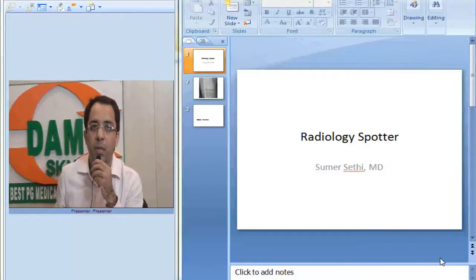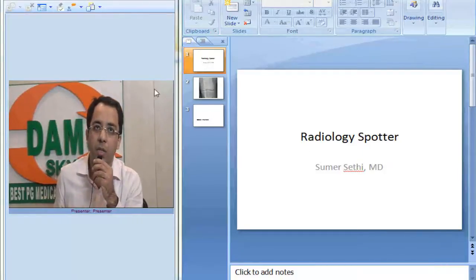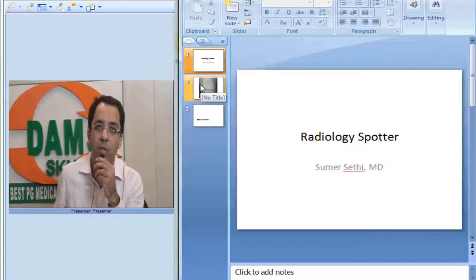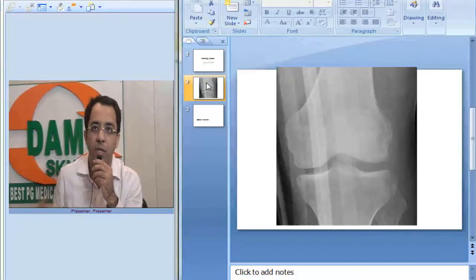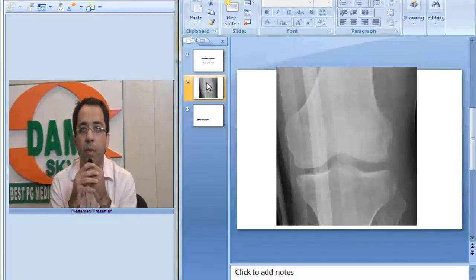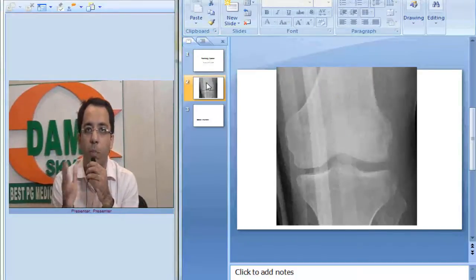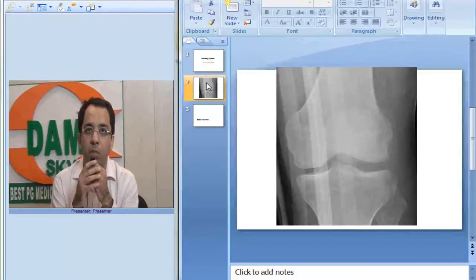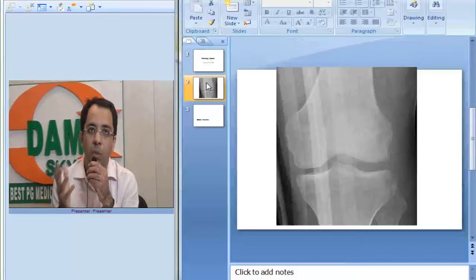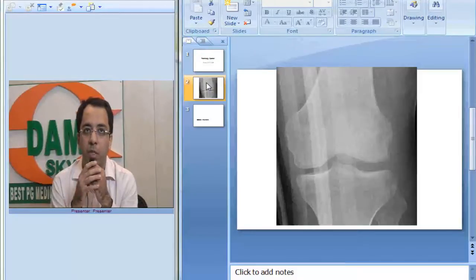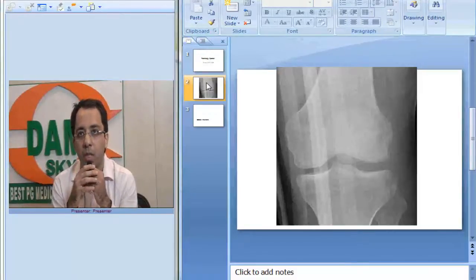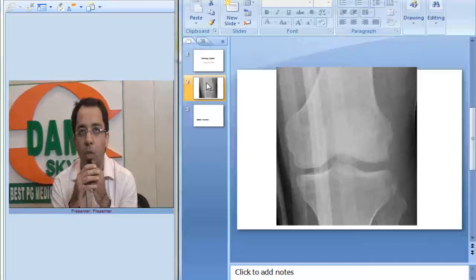Let us see the image and try to make a diagnosis and then we will see what is the significance of this. You are posted in orthopedic emergency as a radiologist to read x-rays and this x-ray comes to you. What do you think is the finding?